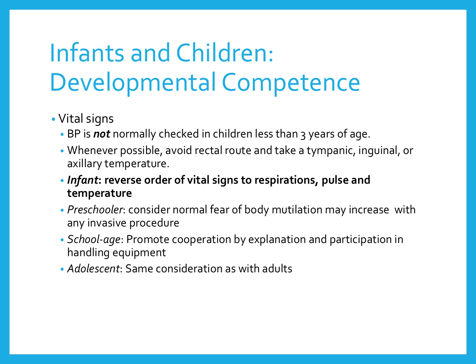Now, we don't usually check blood pressure in children younger than 3. It's just not a pleasant experience for them, and they're not going to give us a whole lot of information with a blood pressure, because you don't see a whole lot of 3-year-olds with hypertension or cardiovascular disease. We're not screening 3-year-olds for hypertension. We will avoid the rectal route if we can and use other routes of temperature taking for children, and axillary is the best way unless they can follow your directions for an oral temperature.